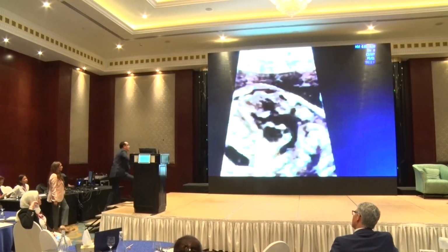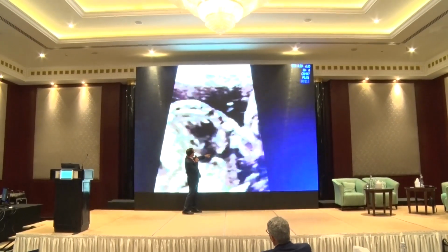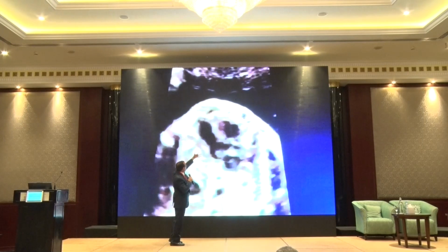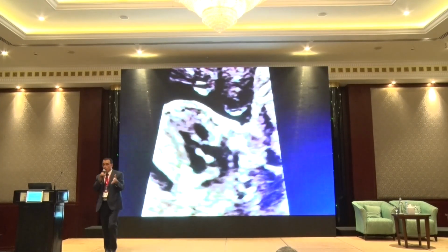There you can see. So this is the single... I'm getting lost. Yeah. What is this? There. So you see the branching coming out for the head vessels, and usually that doesn't go with a duct.